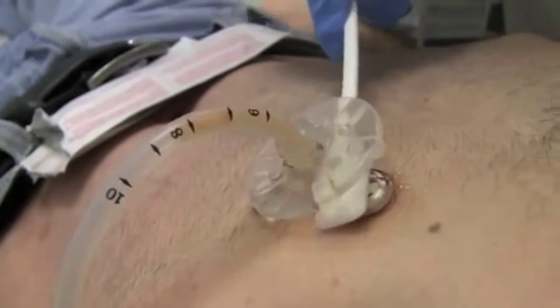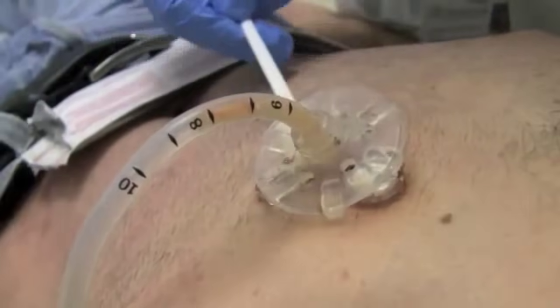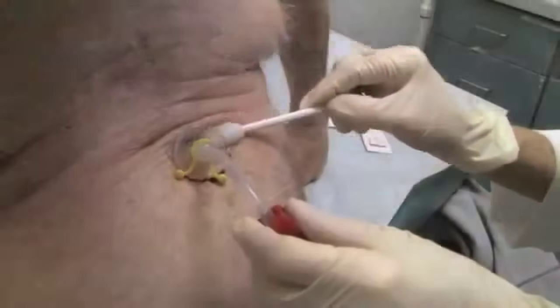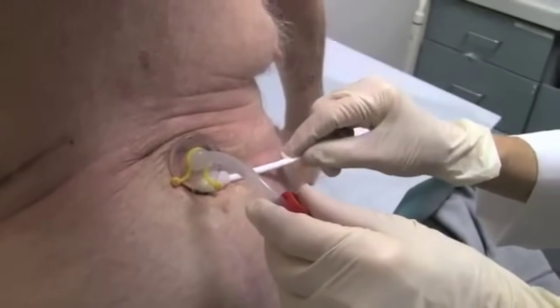Clean the skin under the tab and around the tube every day with a Q-tip dipped in normal saline. Imagine the Q-tip is an arm on a clock, and clean in a clockwise manner around the tube. When you're in the shower, clean the skin around the tube with a mild soap and water, and ensure that you're drying the area completely when you're done. Do not take baths, and gauze dressing is not necessary unless you are having drainage from the tube site.